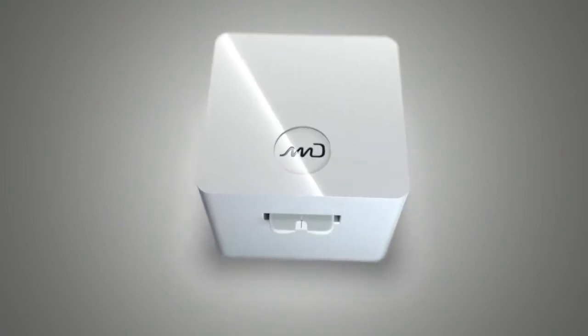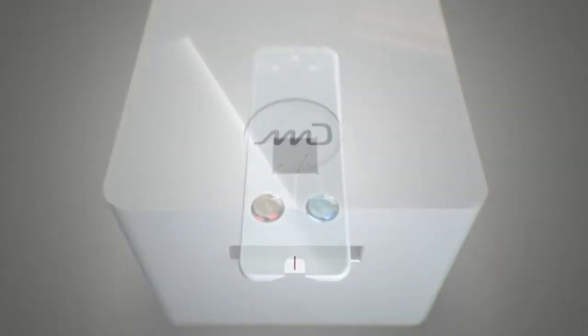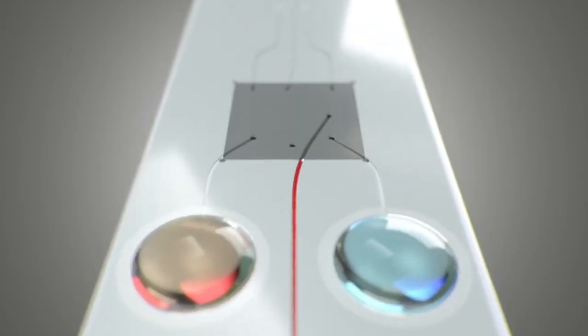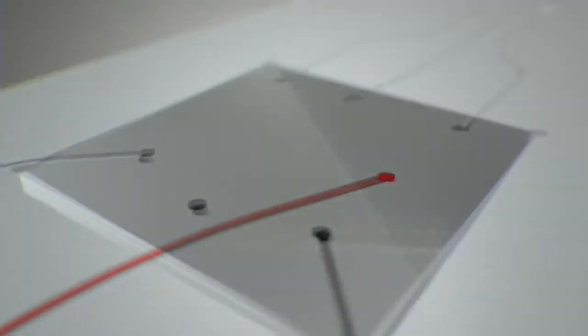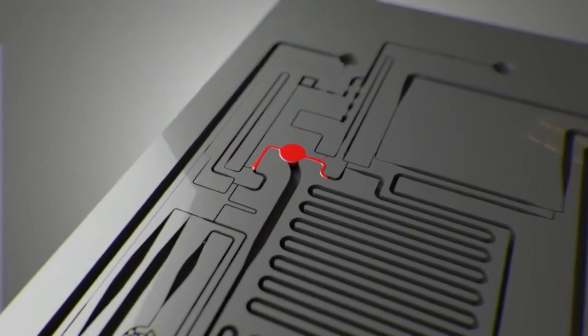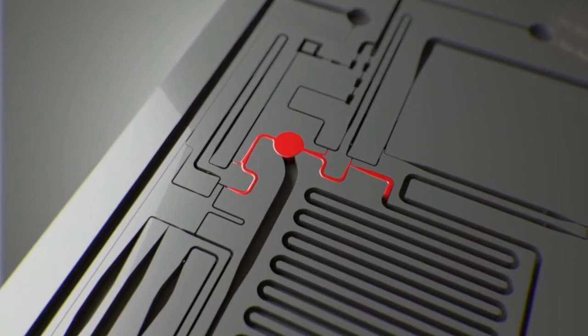The test card is inserted into a reader for testing to begin. Next, capillary forces draw the sample in the test card towards the nanofluidic processor, built out of two layers of silicon, allowing the blood to be distributed throughout a network of precisely engineered microchannels.